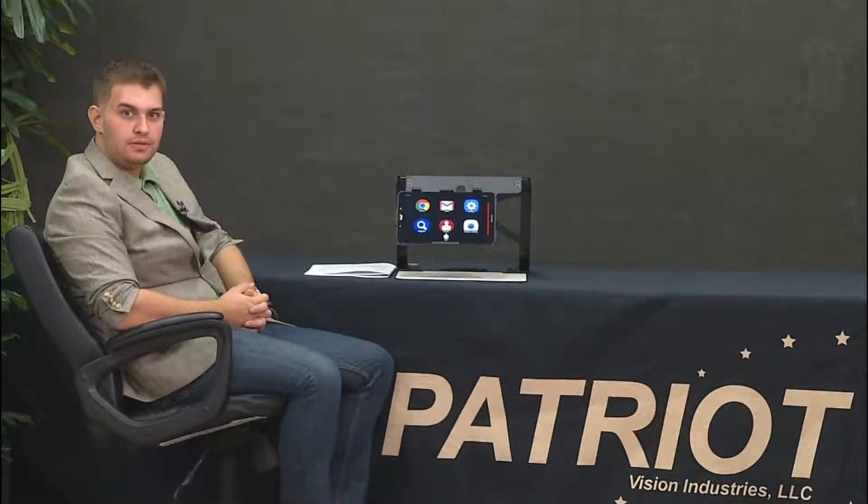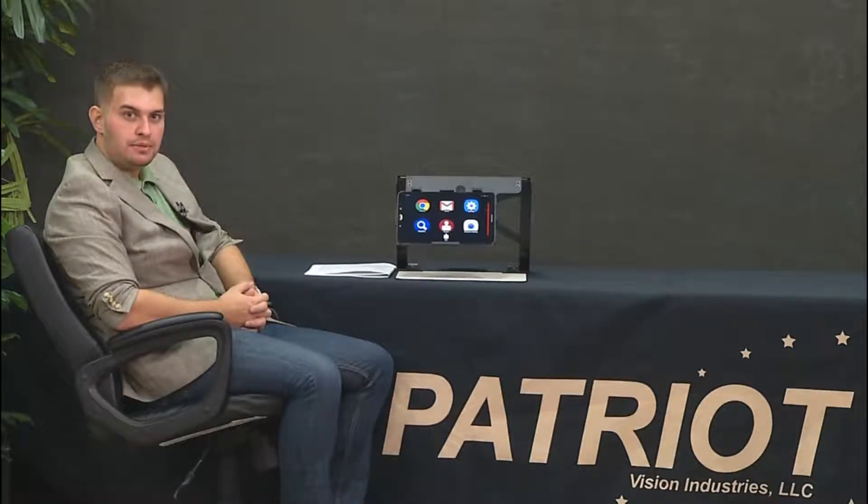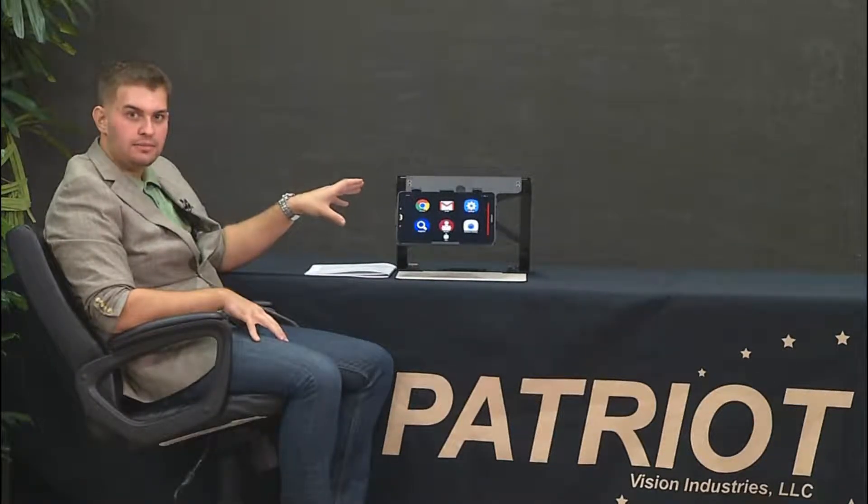What this device is is a fully operational Samsung Galaxy Tab A that will be used not just to magnify documents and read out loud, but it's also a fully functional Android based operating system where you could browse the web, check your email, watch YouTube videos, and so forth.